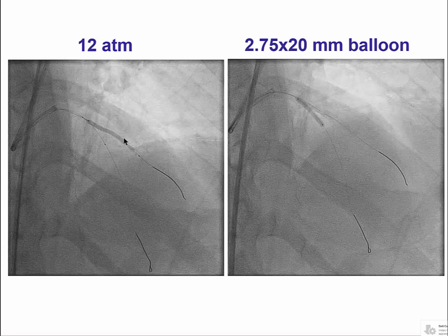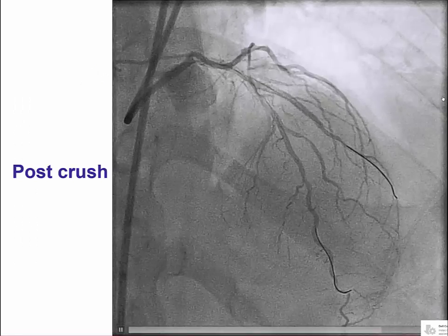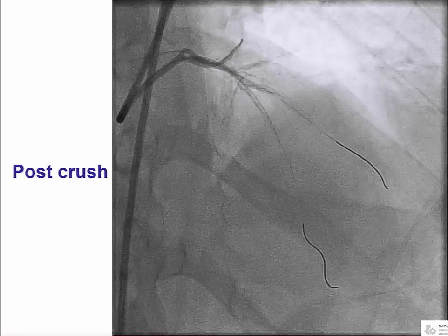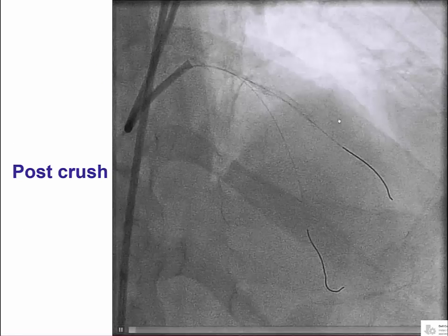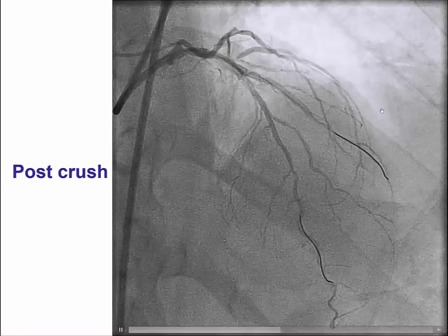After removal of the stent balloon, the side branch stent is crushed. We used a 2.75 by 20 mm balloon in the main vessel to crush the side branch stent. This is the angiographic appearance after crush, demonstrating good patency of the side branch with flow still present in the LAD.